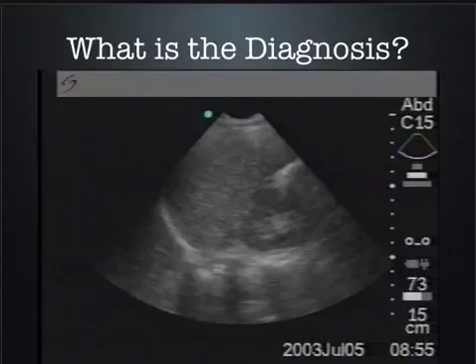Here's the liver. Here's the kidney. Is it positive or negative? Positive. All right. So look at the date on this. This is the very first portable ultrasound machine ever made. This is the Sonosite 180 Plus, which we still have. We actually gave it to the vet the other day, so we can use it in helping us out with some other stuff. But the reason why I showed this is because the screen is so small that the dots are really close together. So this is still about a 1/2 centimeter stripe of fluid.